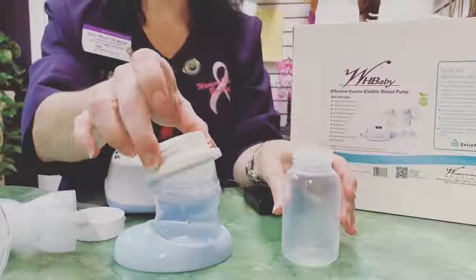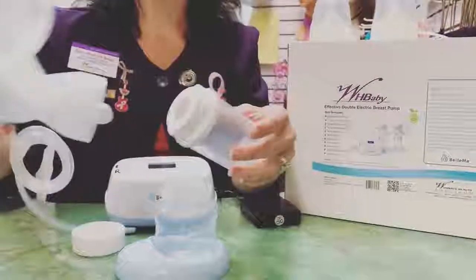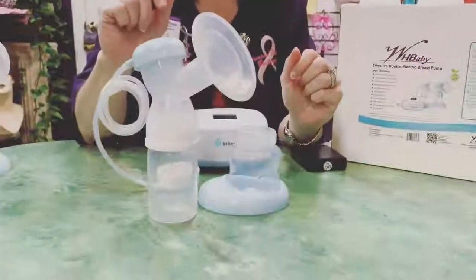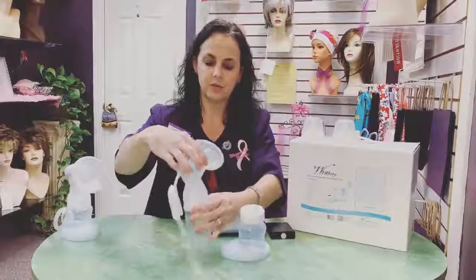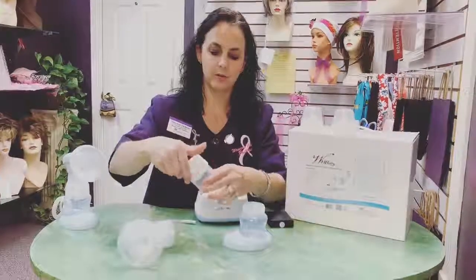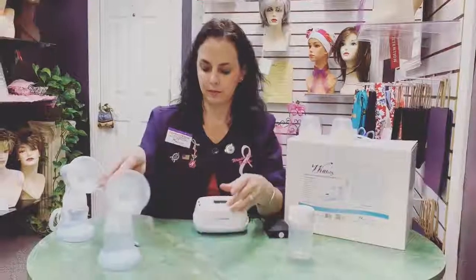You're going to take the little white flange cap cover on here. You're going to just gently put it onto the top of the small neck bottle. You can screw right into this, and then you can pump into any of your small neck bottles. So you're not wasting your bottles. The cap works on either the large or onto this one after you take it off. So if you're pumping going down the road, you just gently put the cap back on there, throw it in the cooler, and you're ready to go. Now let's move on to your pump itself, the motor.